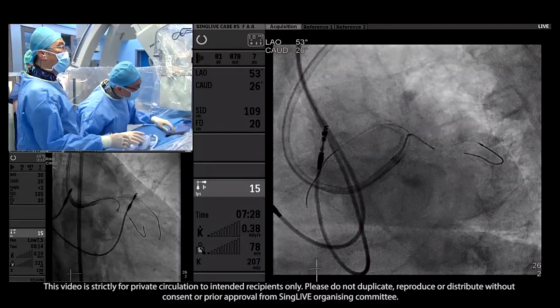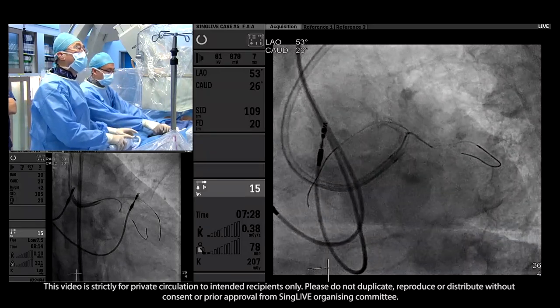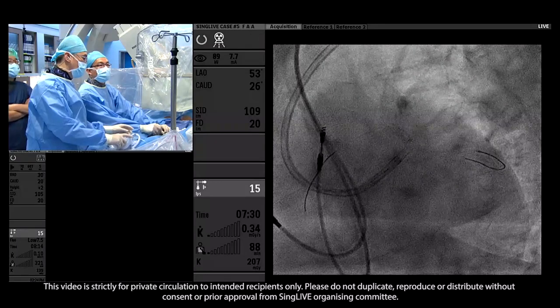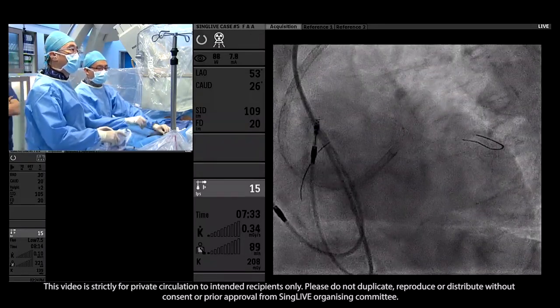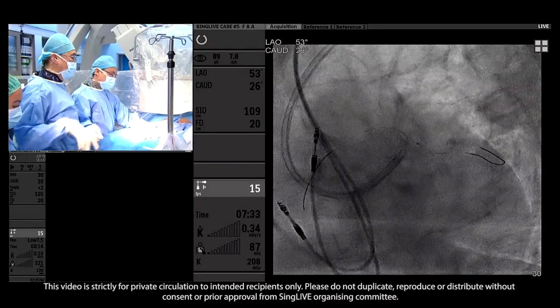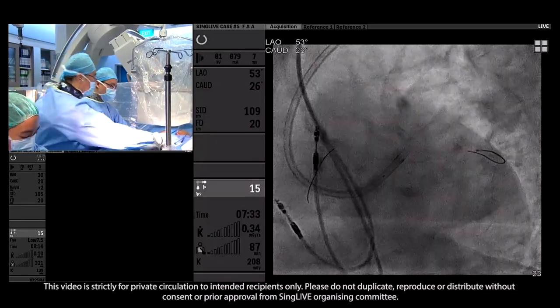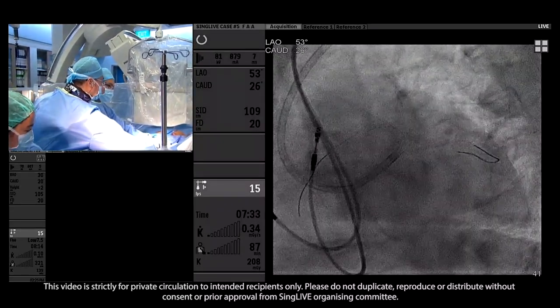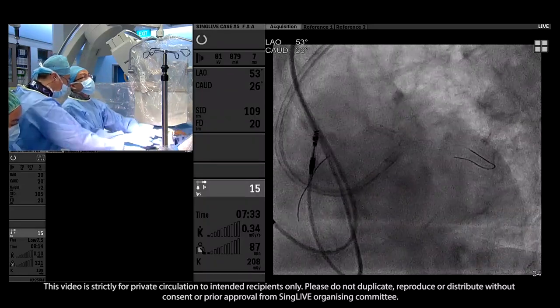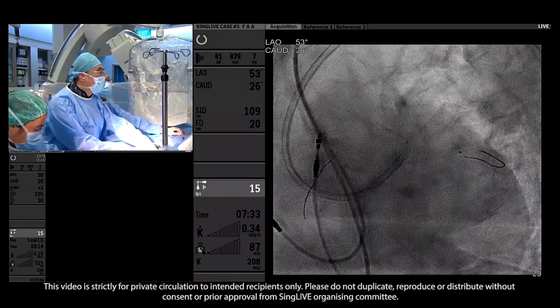Dr. Mehta? I think the data shows that the DK crush has the lowest side branch restenosis rate, and it's feasible to be able to do a DK crush in this kind of a case. I'll prefer DK crush over TAP. Yeah. Dr. Hone? I think the TAP technique, if the lesion cannot be finished with the scoring and DCB, then I would do TAP. Dr. Okazaki, from your preference, bifurcation technique?